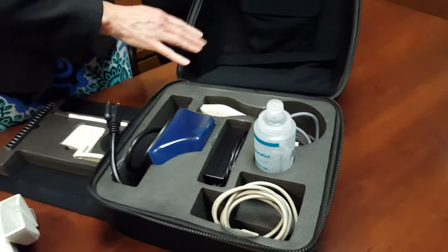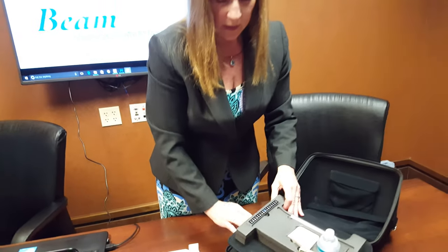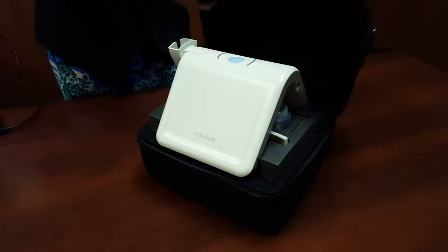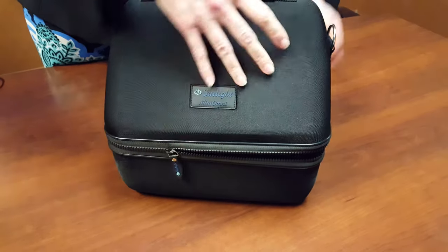Keep the probe safe in its spot. Then put that away, the top layer returns, the Mini Omni main unit goes back to its spot, and then zip again.